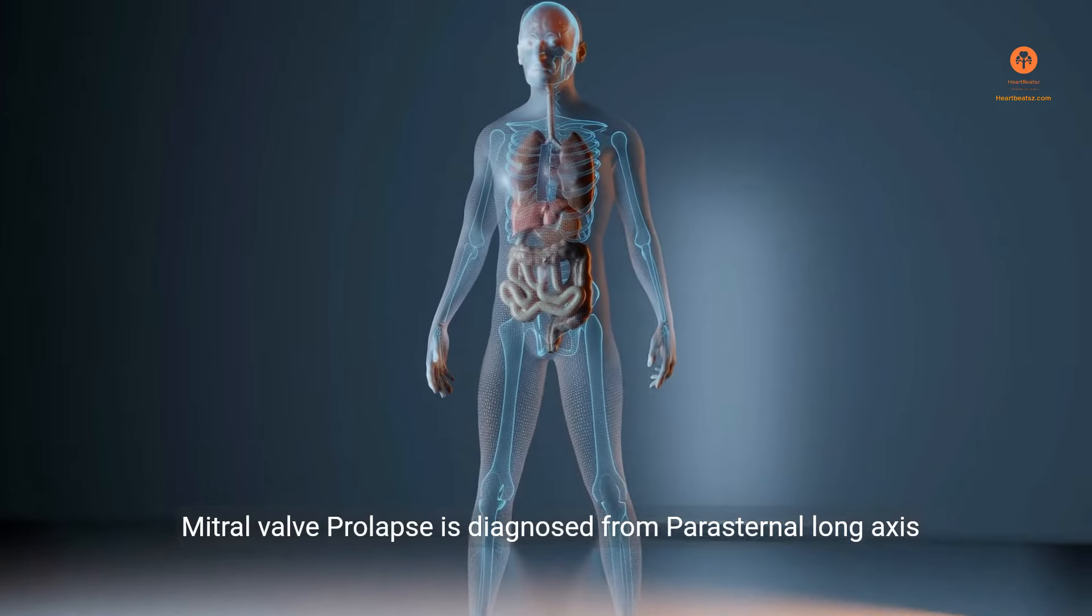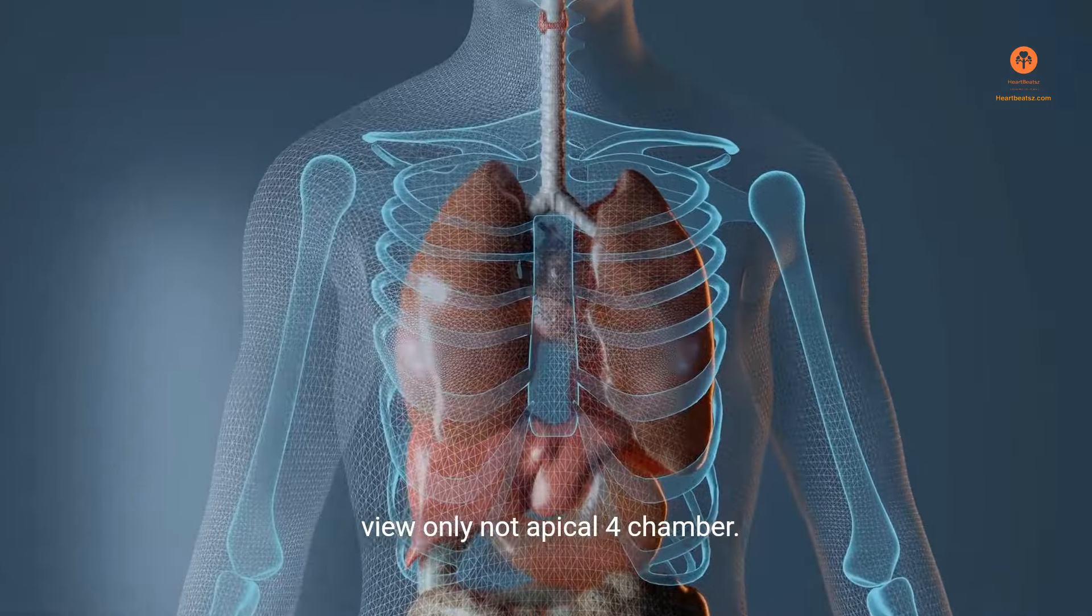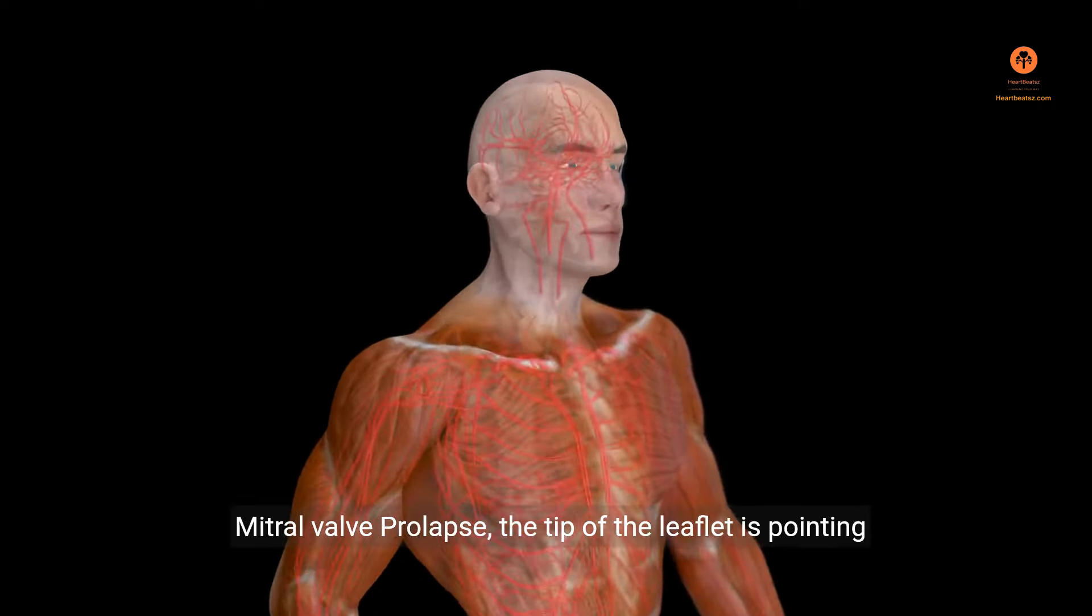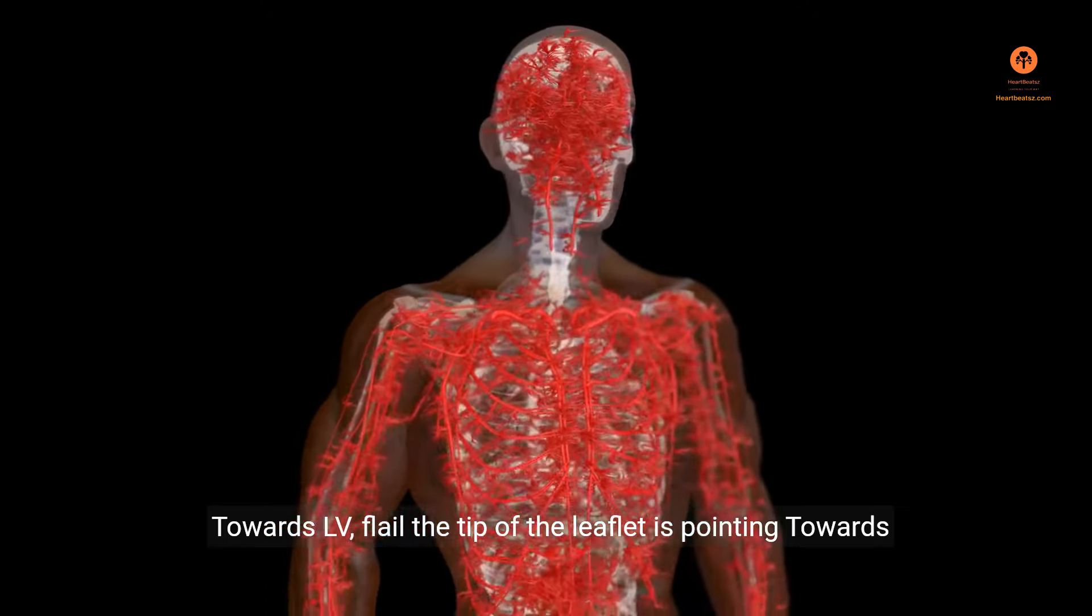Mitral valve prolapse is diagnosed from parasternal long-axis view only, not apical four-chamber. In mitral valve prolapse, the tip of the leaflet is pointing towards LV. In flail, the tip of the leaflet is pointing towards LA.